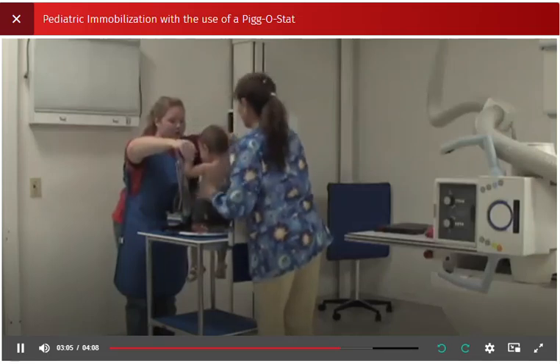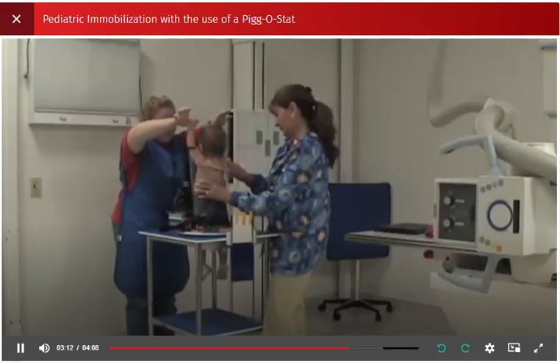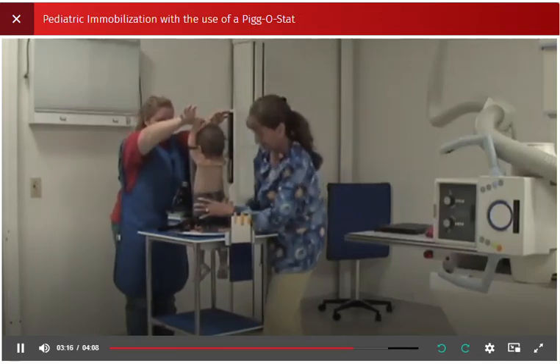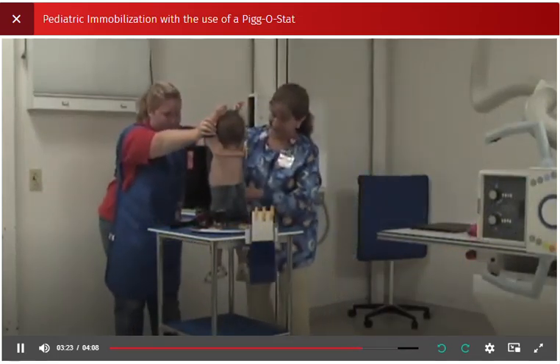Once the child is safely seated, the technologist will close the plexiglass supports and lock them into place. Secure the leather strap behind the child's head to immobilize the child. Instruct the parent to stand facing the child's face and have him or her hold the child's hands.